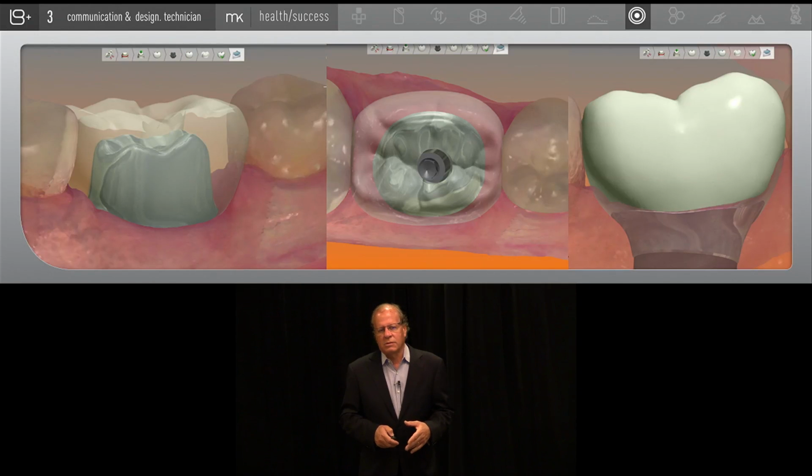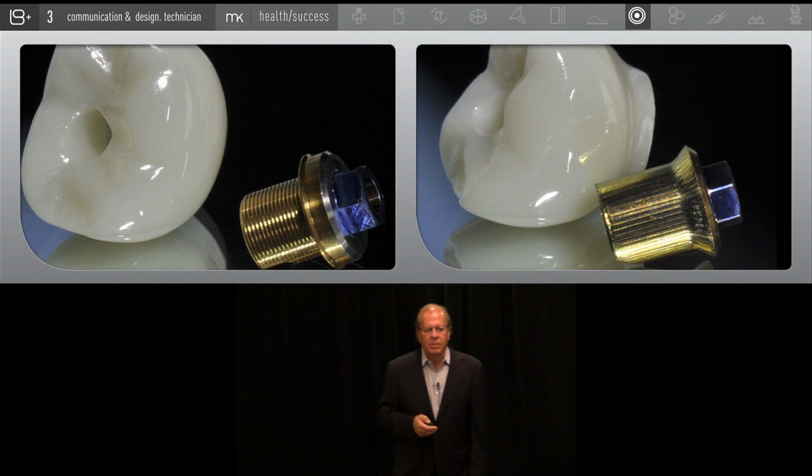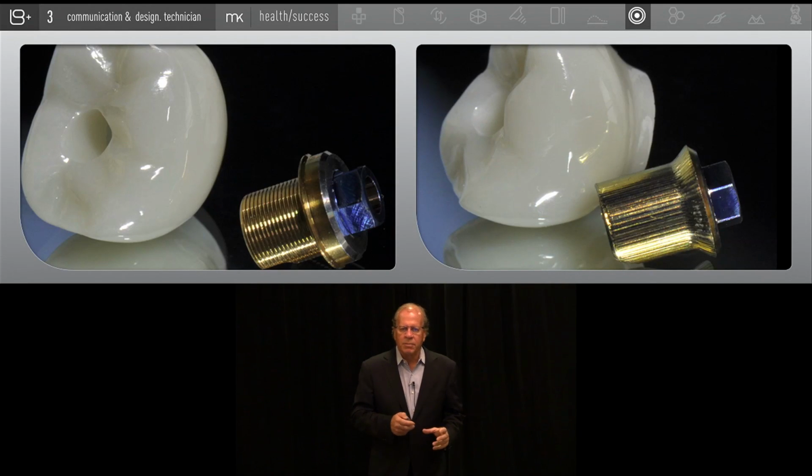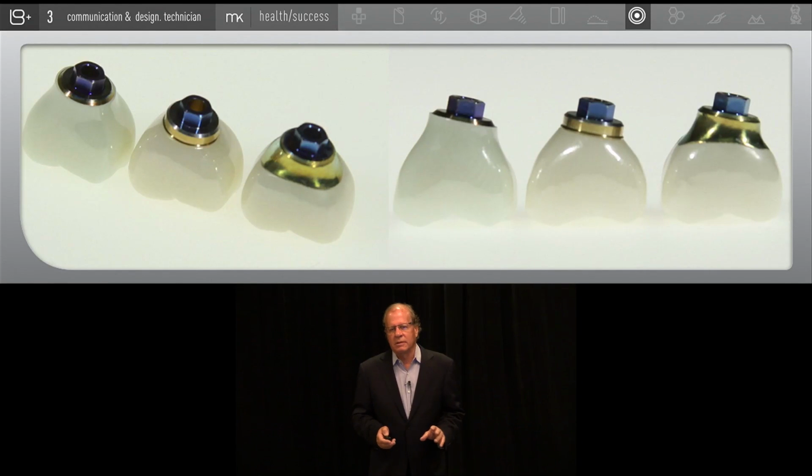And in this case, it's a screw hybrid type restoration, a monolithic zirconia crown milled with a titanium base, which is resin bonded to the body of that, and the crown in position. So we have total screw access retrievability for these. I usually do all of my posterior crowns as screw retained. And you are probably more familiar with smaller abutments, smaller titanium stems. It doesn't really matter. I can show you a whole variety of designs that I use.